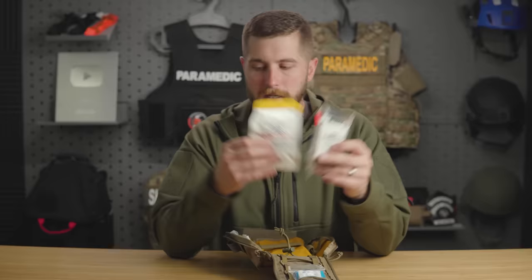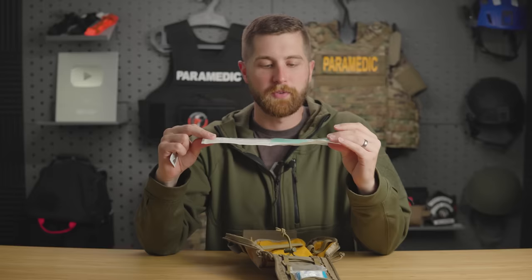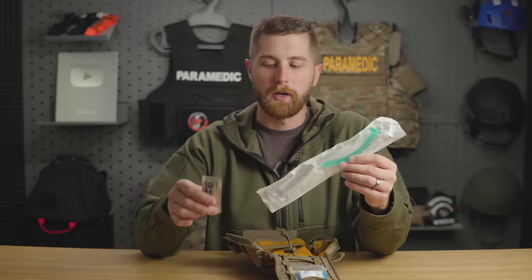On the right side, the right wing, we have a nasopharyngeal airway. So this is a 28 French, it's a 7mm nasopharyngeal airway, standard adult size. Carry one of these. I don't bother with OPAs anymore, really. This is a great airway. It works excellent in a pinch, and you can put it in somebody with a gag reflex or somebody without. And it does come with a little bit of lubricant on that as well.